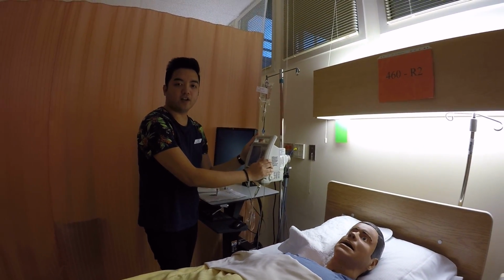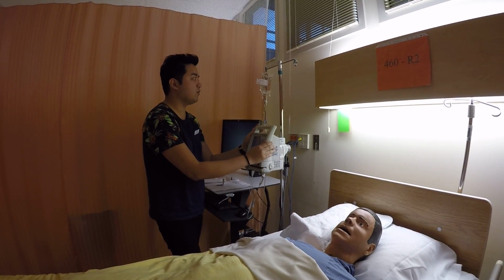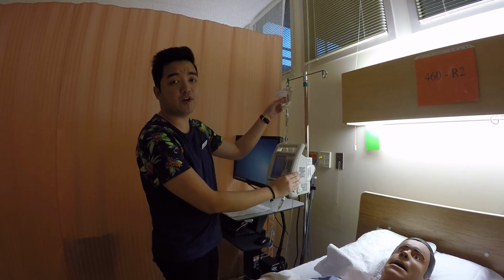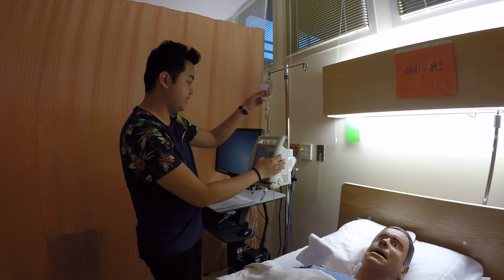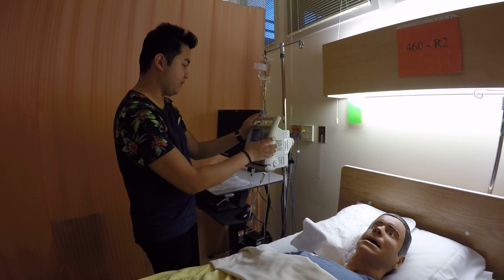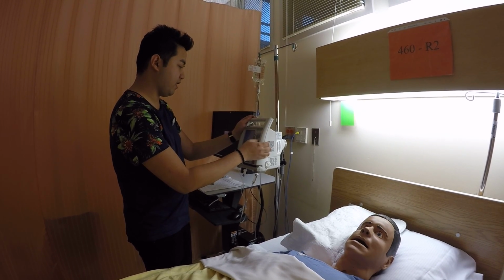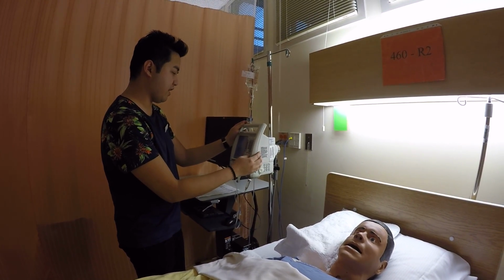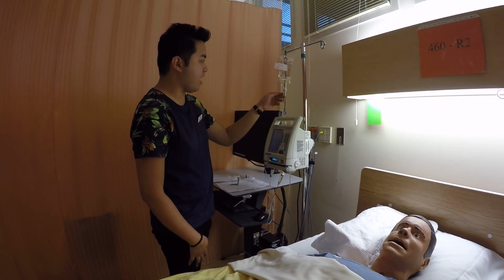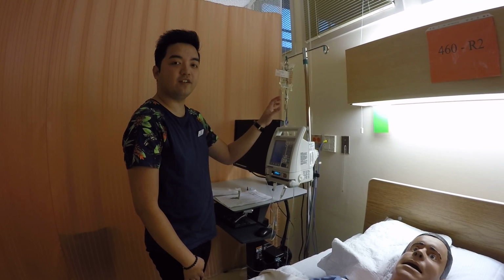So as I mentioned to you a while ago, I want the medication to be set to be infused over 1 hour. So what I would do is the total volume in the bag is 115.8, so I can round it off to 116. So I'll put 116 ml per hour, and then the volume is 116 as well. Okay, and then I confirm secondary, and then I start. Once it's starting, I need to check if there are 1 to 3 drops here. Okay, so there you go. I see the first drop coming in.